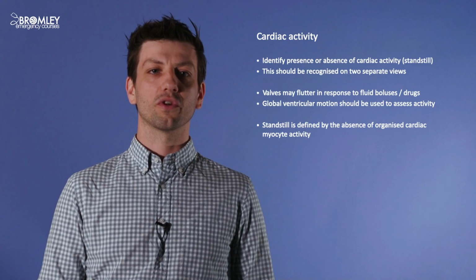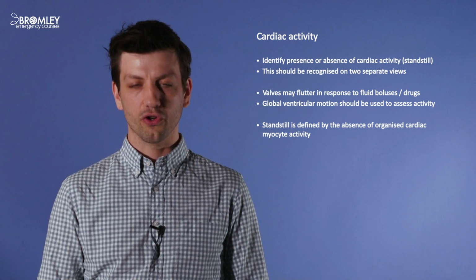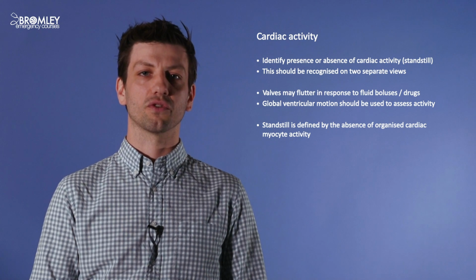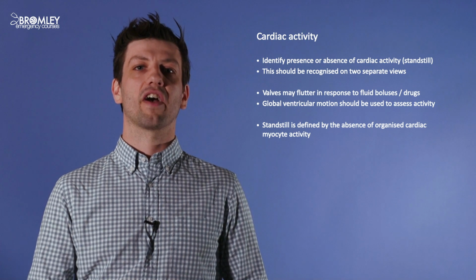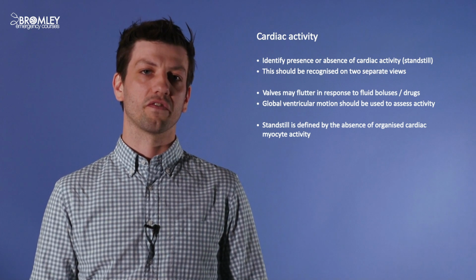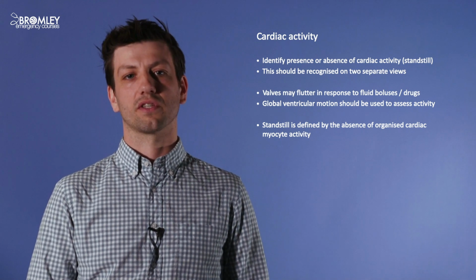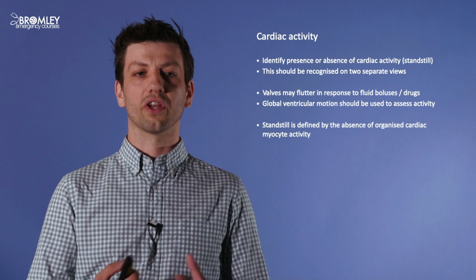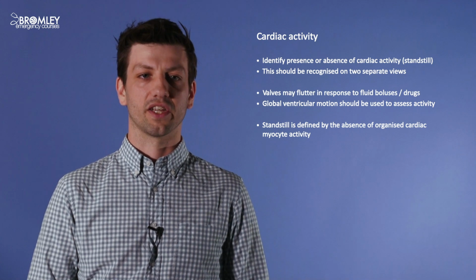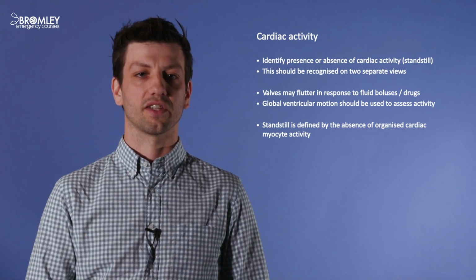So the first thing we want to do is identify whether that heart is beating, and you should try to identify this on two separate views. You may see that the valves flutter in response to fluid boluses or drug boluses. That does not count as cardiac activity. Cardiac activity is organised myocyte activity, and you should see all of the ventricles contracting.